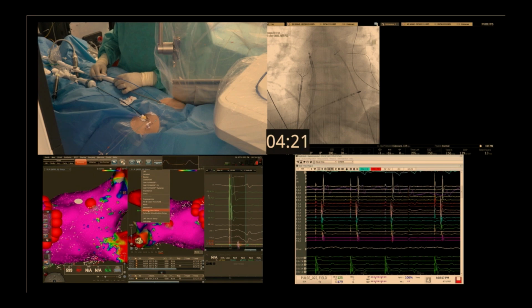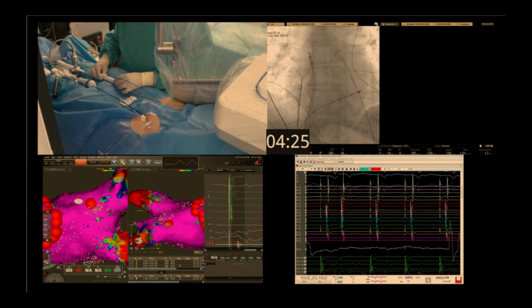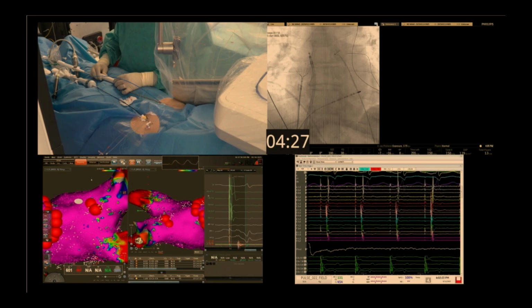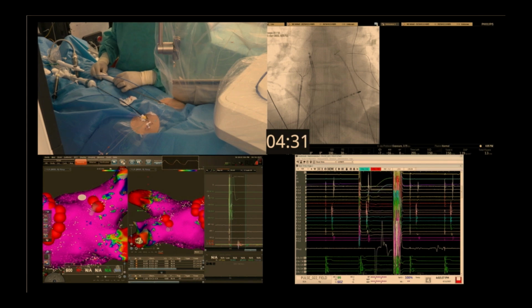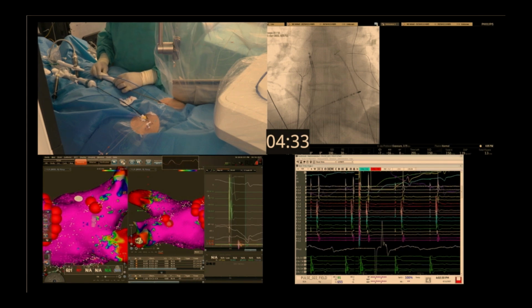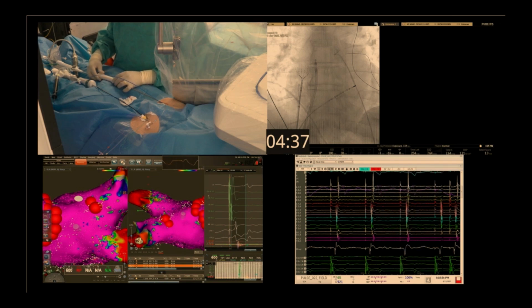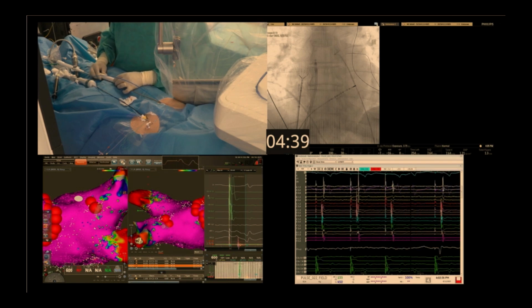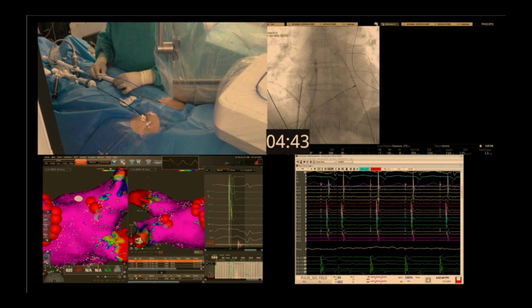Yeah, we feel confident enough, obviously, that we're continuing to treat patients. So, you can take it for what it's worth. Yeah, and then here, again, we're going to go to the right side and start isolating. In terms of safety assessments, PV stenosis, we're not really worried about. Obviously, we're going to assess this.